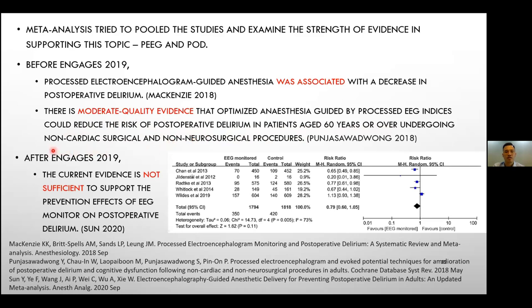But due to the highly discrepant results from ENGAGES 2019, the current evidence is not sufficient to support the preventive effects of the EEG monitor on post-operative delirium, by Soon in 2020.